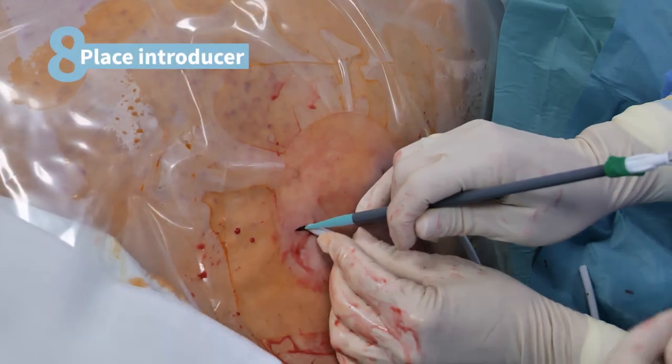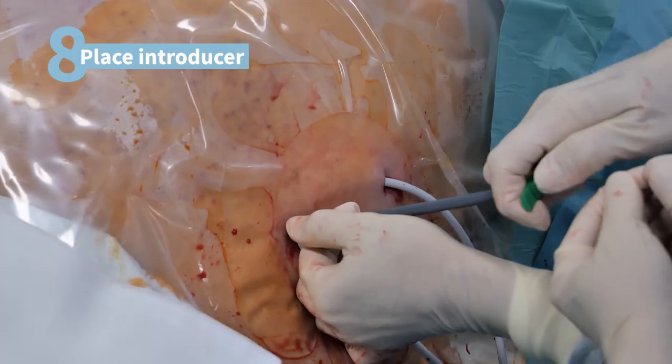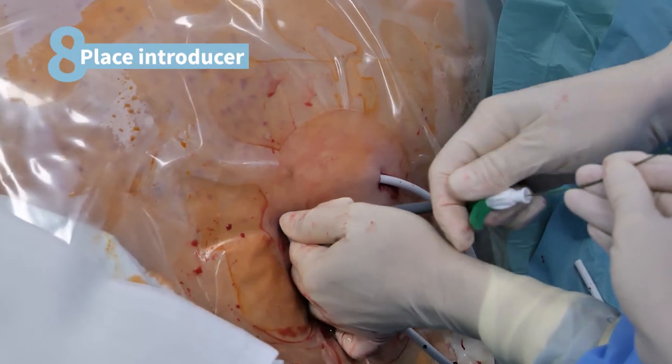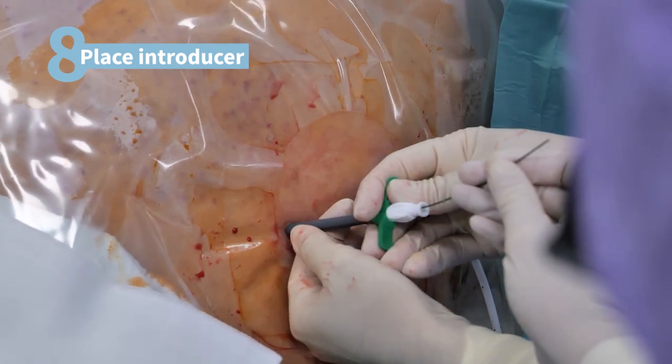Now the introducer is threaded over the guide wire and inserted into the subcutaneous tissue, where it is also advanced with gentle pressure and twisting movements until the tip of the introducer is located intra-abdominally.